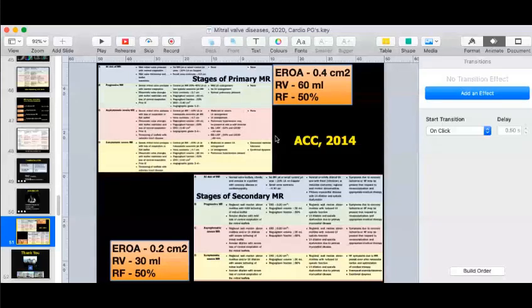If you are looking at, for example, an acute MR where there's hypotension and the left atrial pressure is going to be increased, you're going to look at a flow which is going to be of very low velocity. Then you can decrease your velocity scale, bring it down so that your MR is seen much better. So that is the range, 50 to 70. When you feel that there is tachycardia and you're not seeing the MR properly, you can go above 70, but be very careful when you do these parameters because you should know what you're doing. Anything less than 50 for low flows, anything above 70 for high velocity flows, for example in a patient with anemia or tachycardia, where a lot of aliasing is occurring, you increase the scale. That is as far as the aliasing velocity is concerned.